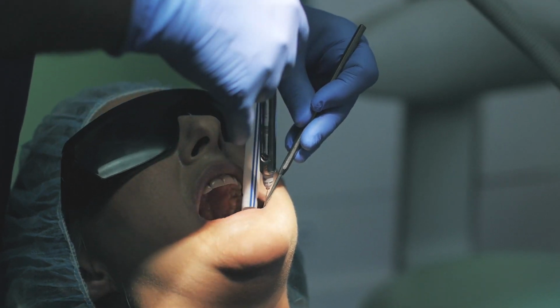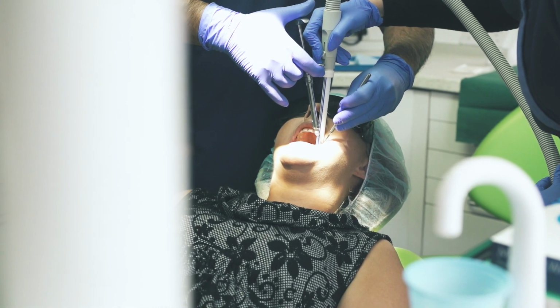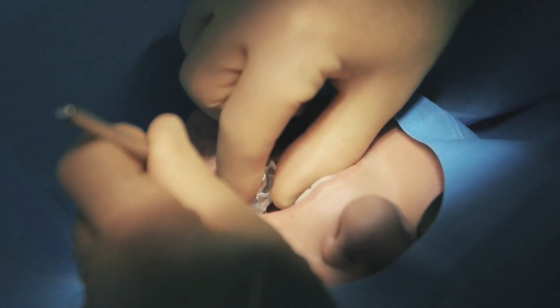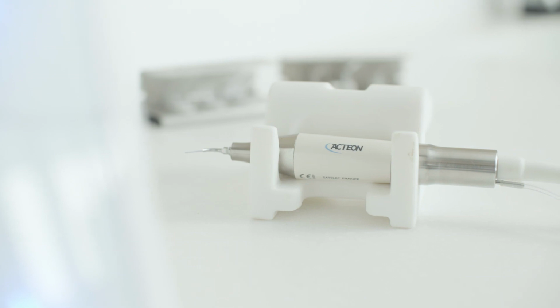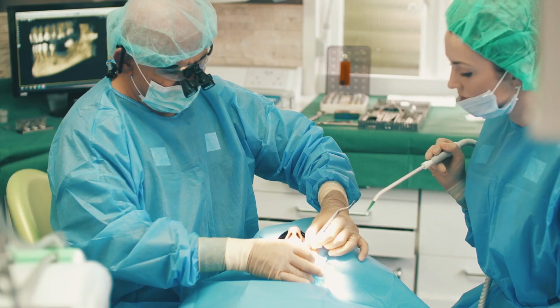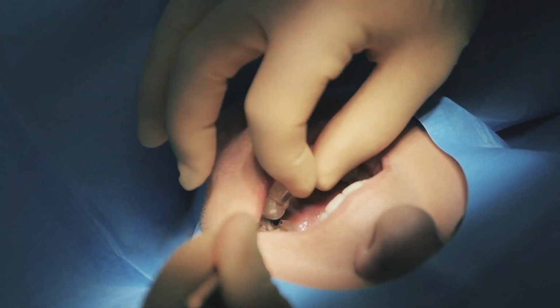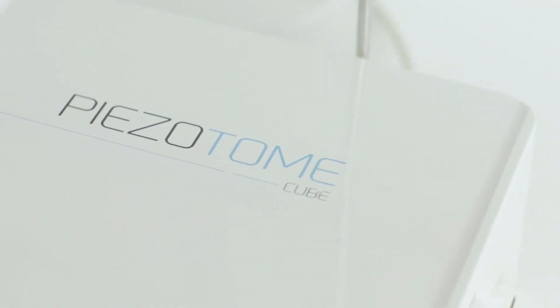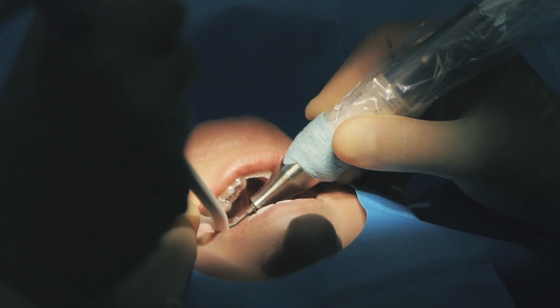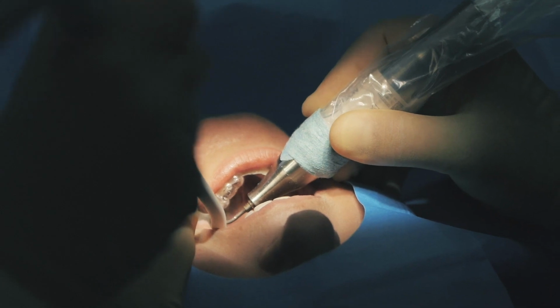The way we do things today in my practice is completely different than we used to do many years ago. Because now we can combine the Immerse's accurate images with the cube's accurate performance. And that way we have a win-win situation for everyone, the patient and for us alike. Because of the nature of the cube being so easy to use, so fast, so powerful, and so efficient, we decided now to use it every case.